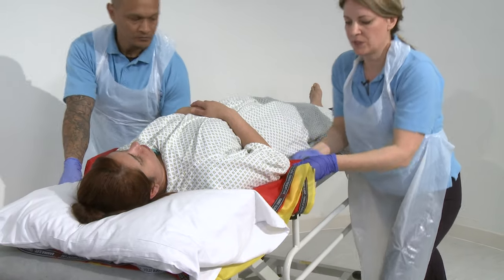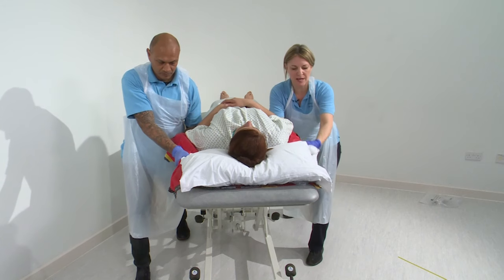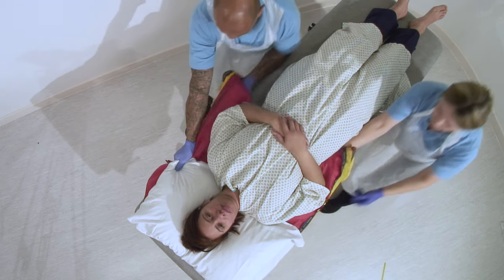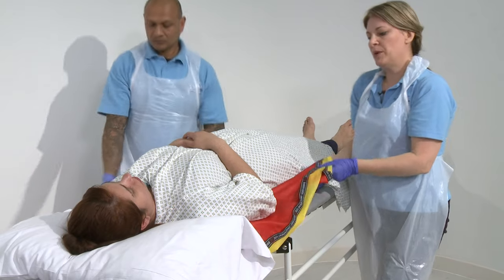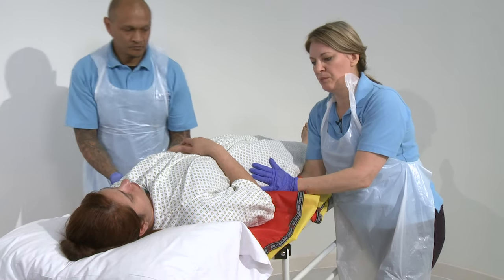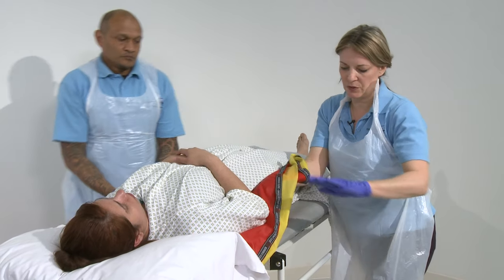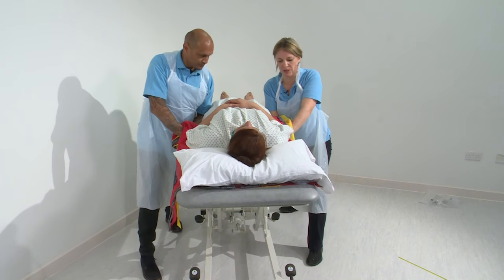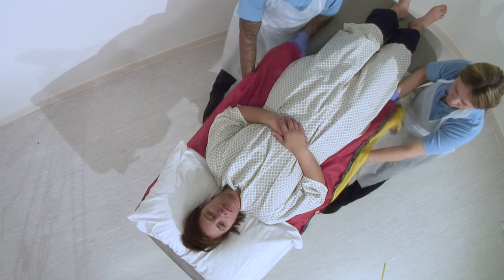Hands back in again, nice long lunge, elbow into that bed, take hold of the slide sheet again. Ready, set, slide. When we get to the hips we may have a bit of a problem. So what we might need to do is just pop our hand onto the surface of the mattress, push hard down into the mattress. Ready, set, slide.